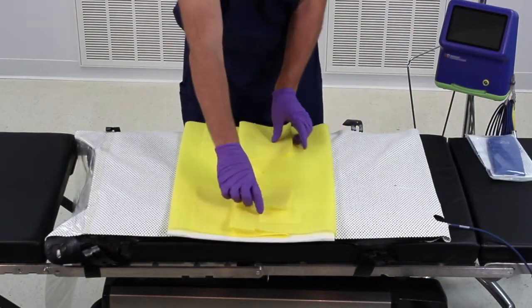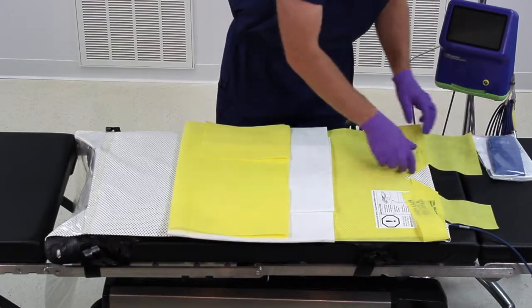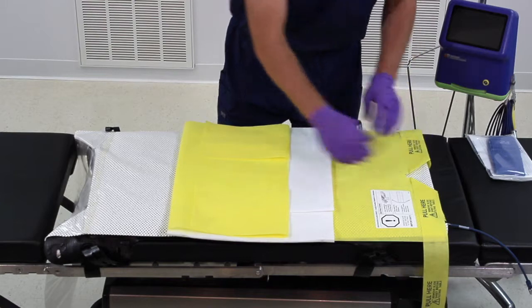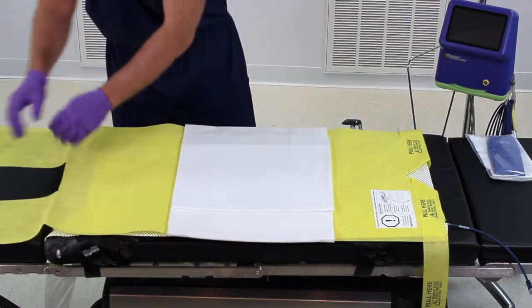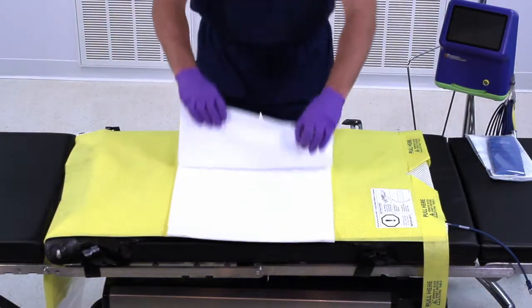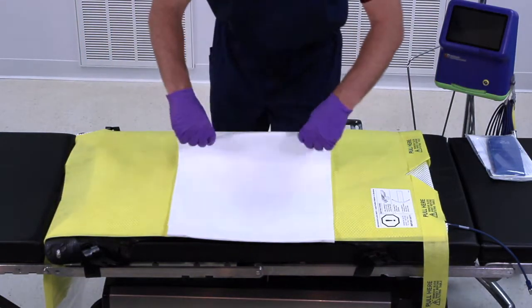Align and position the Backsaver slide sheet by unfolding it over the waffle grip pad. Ensure that the pull tabs are hanging off of the side of the operating table for easy removal. The waffle grip draw sheet should be positioned roughly in the middle of the waffle grip pad.